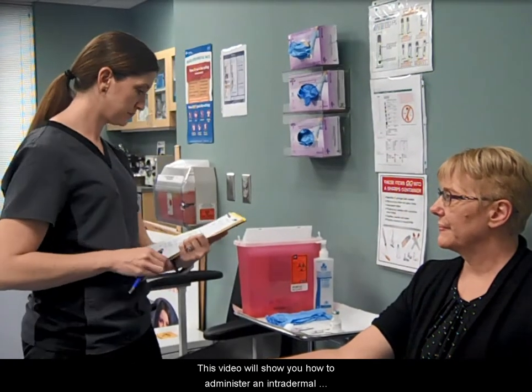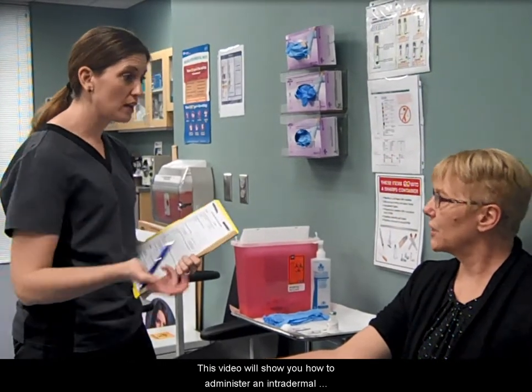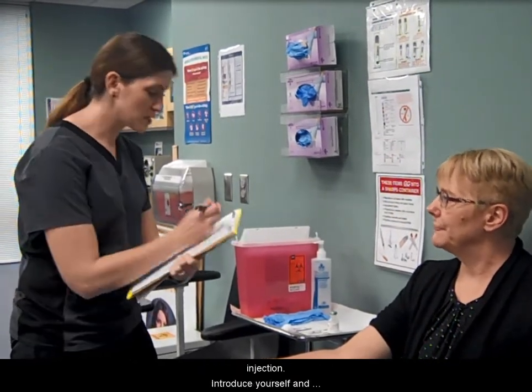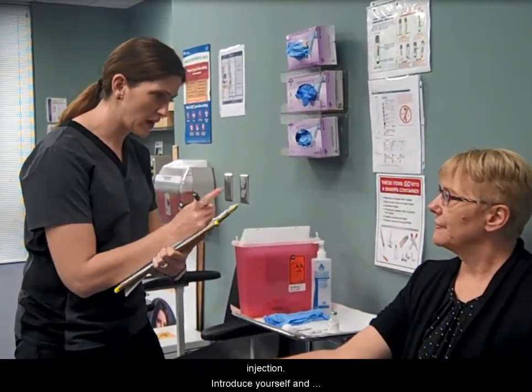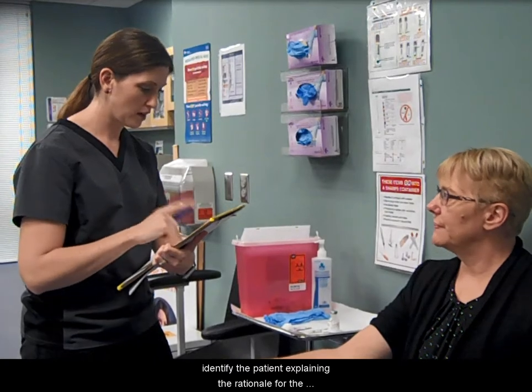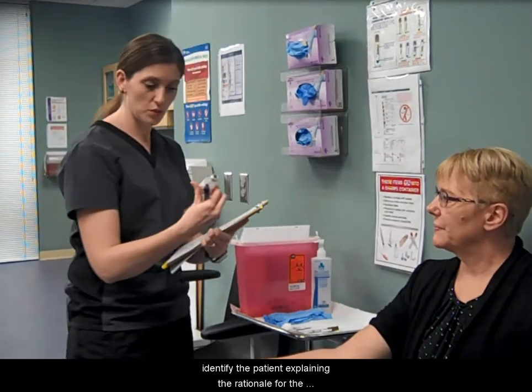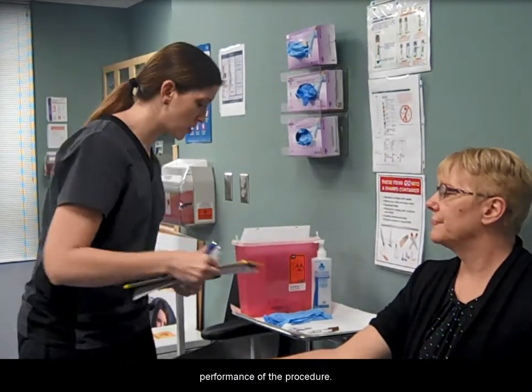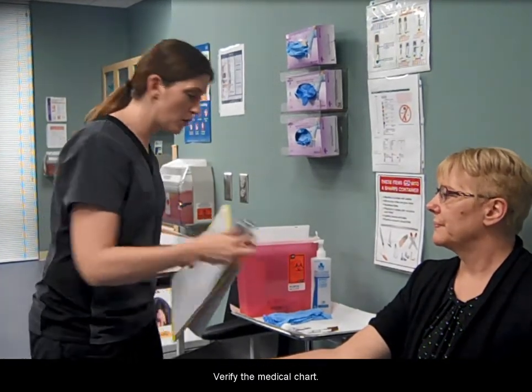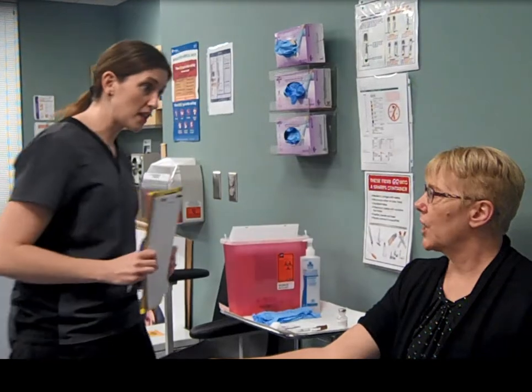This video will show you how to administer an intradermal injection. Introduce yourself and identify the patient, explaining the rationale for the performance of the procedure. Verify the medical chart.